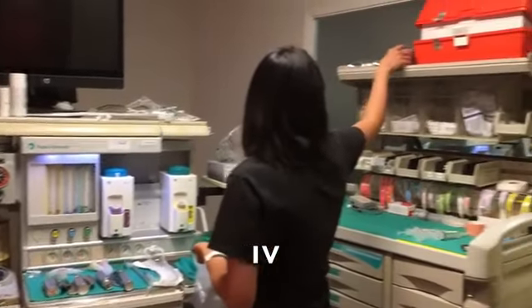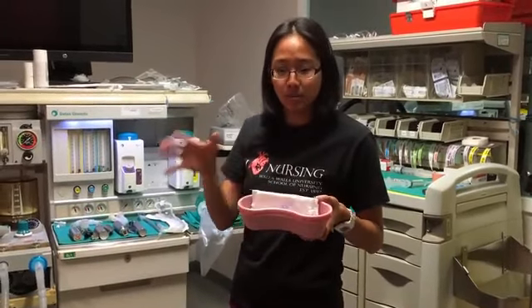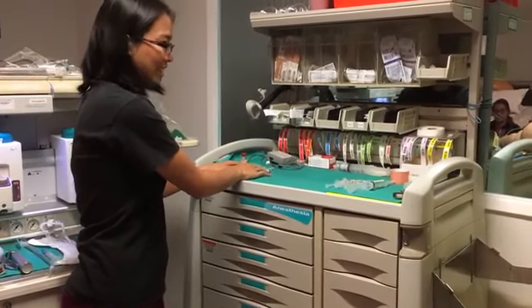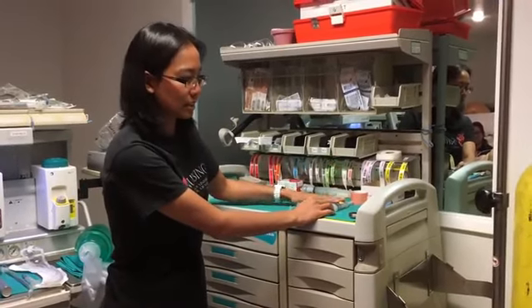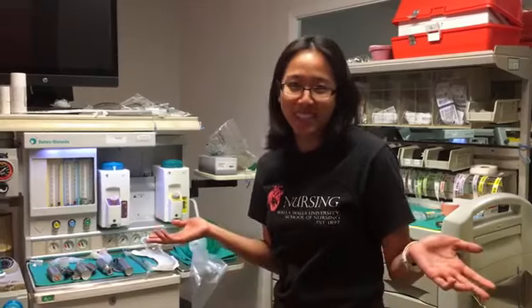I stands for IV. Normally the patient will come in with an IV, but just in case something were to happen, like it gets infiltrated or yanked out, you just want to have a quick IV start kit set up in a basin like this nearby. D stands for drugs. So you want to have emergency drugs over here on the left. I'll talk about that later. And then there'll be drugs that you use for induction over on the right. And again, I will talk about that later. The last S stands for special equipment. If you might be placing an A line in the patient or an OG tube, NG tube, that can also be some equipment that you have nearby. That's what you do to prepare the room before the patient comes in.